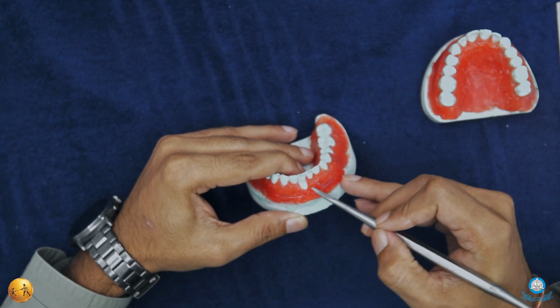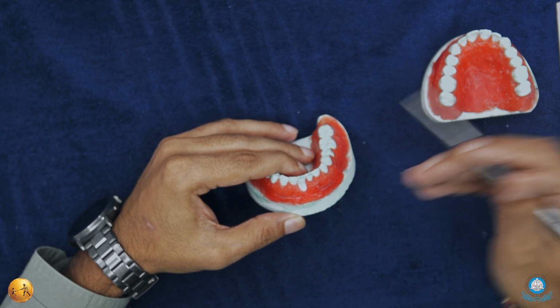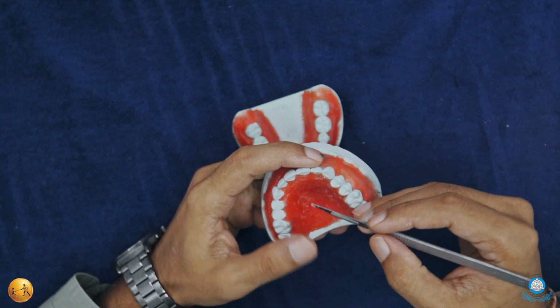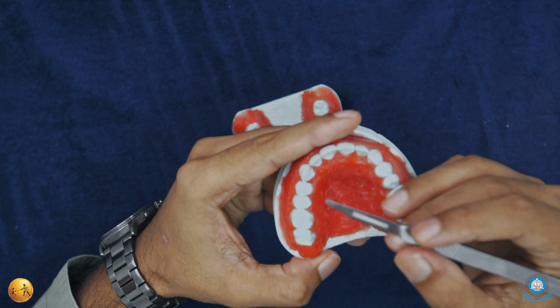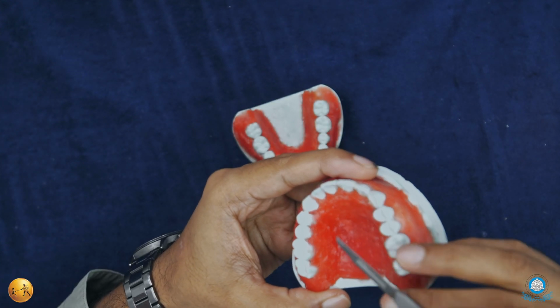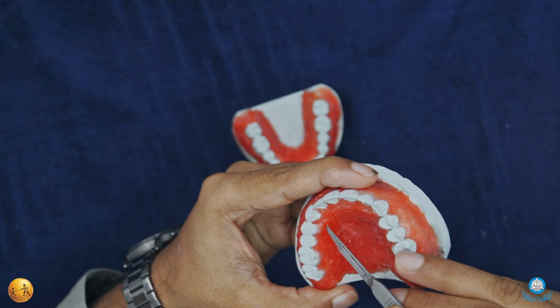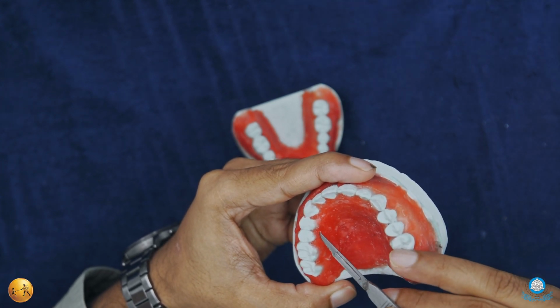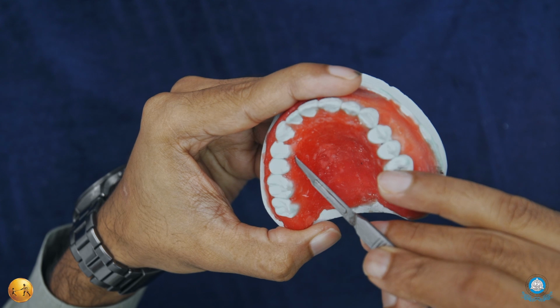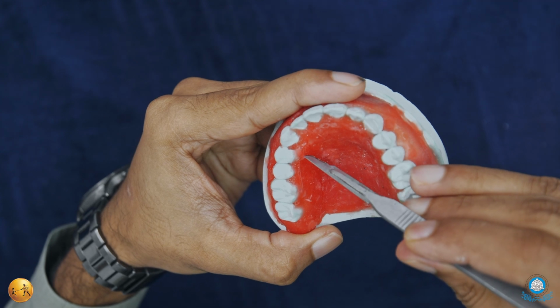Now a template is created which will give us an idea of how much graft we need to harvest from the palate, and accordingly the site is selected. So free gingival graft can be harvested from the palate. As I said, the extension is from the distal of canine to the distal of first molar. That is normally the zone. It should be about 2 to 3 millimeters away from the gingival margin, and outline the area of graft that you want to harvest.